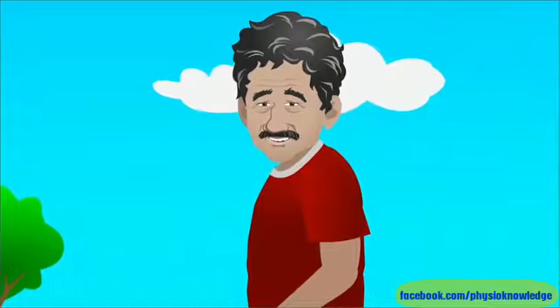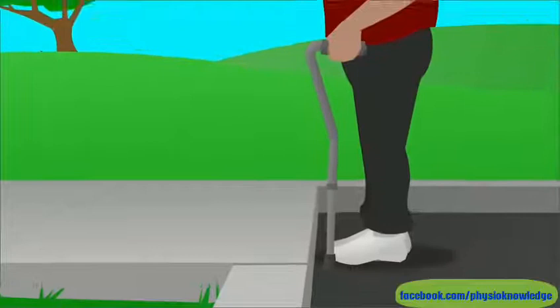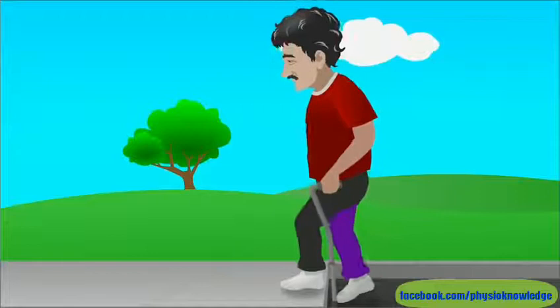Here's how to use your cane on curbs or stairs. Be sure to have someone with you until you feel safe and steady using your cane. Stand near the edge of the curb or stair and get your balance. If you're going up, step up with your strong leg first. Then bring the cane and your weak leg up to meet it.